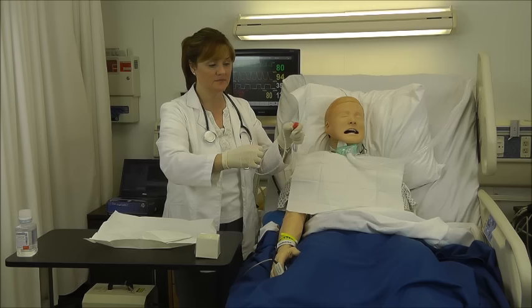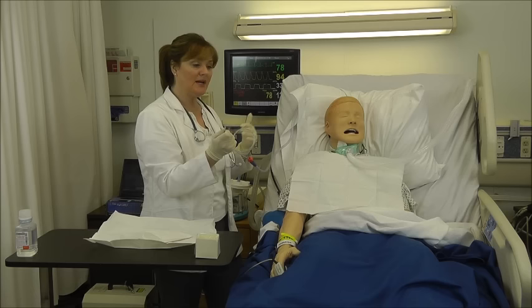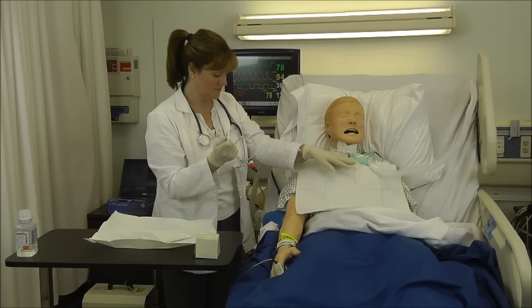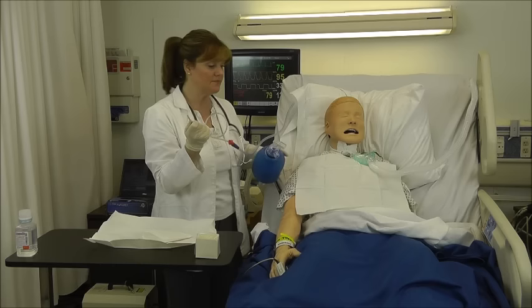I see that his pulse oximetry reading is down to 93%, and when I suction, I'm going to be pulling the oxygen right out of his lungs. So I'm going to hyperoxygenate or pre-oxygenate him by moving his trach collar to the side and putting the ambu bag that's connected to 100% oxygen on the trach and giving him 3 to 6 breaths.